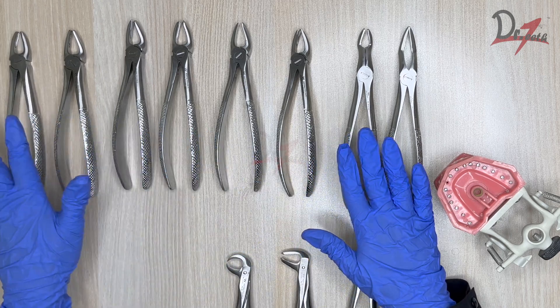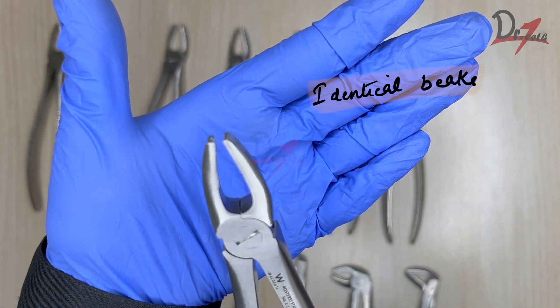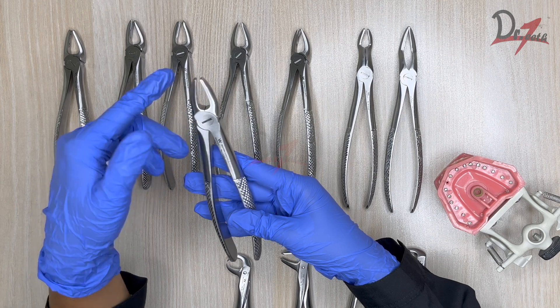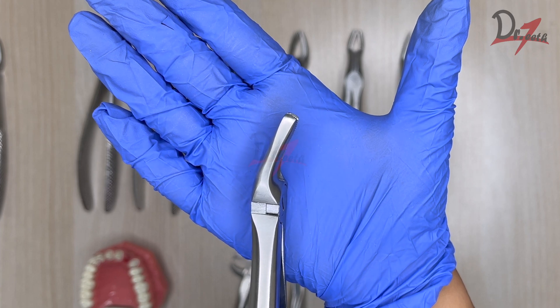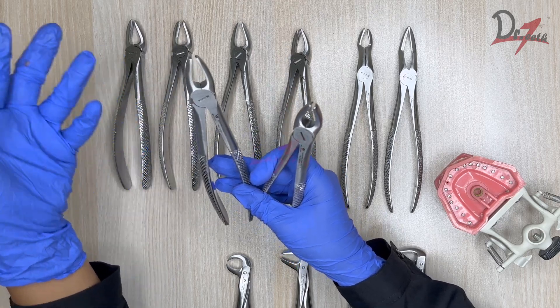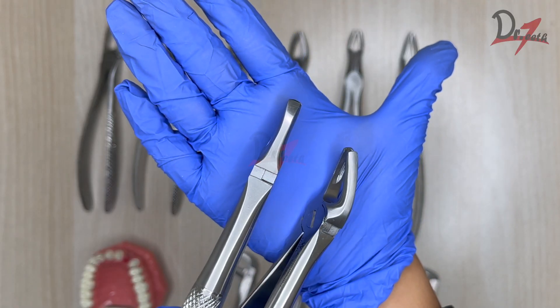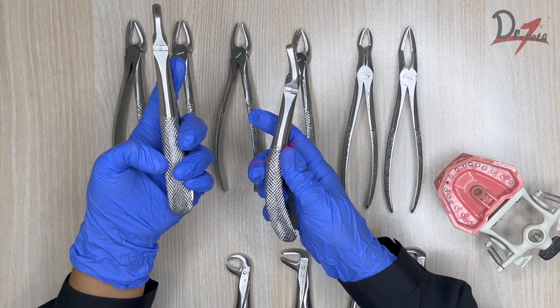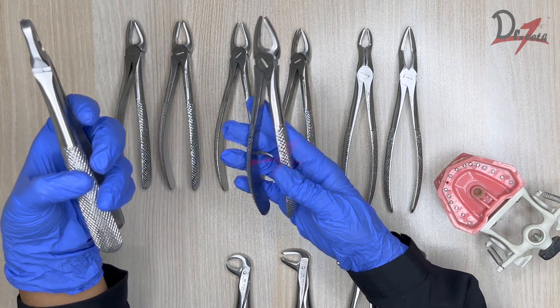Starting with the maxillary forceps — this first one has a little space between the beaks and is for the upper anteriors. Coming to this one, the spacing is almost the same. In my previous video I had shown a different brand where the spacing for anteriors was a little less. This one is the upper premolar forcep — the curvature is different. For this particular brand, the handle design has a slight curvature, whereas the anterior forcep is straighter.